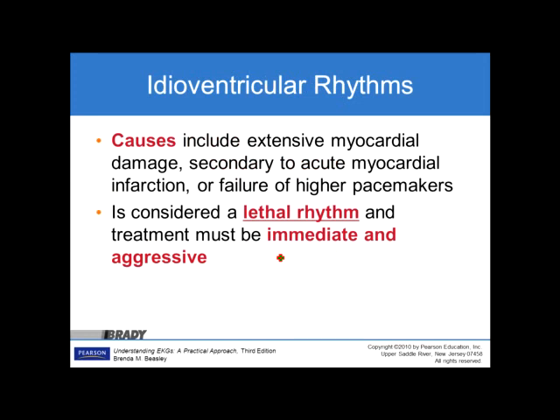Idioventricular rhythm causes include extensive myocardial damage, secondary to acute myocardial infarction, or failure of higher pacemakers. It is considered a lethal rhythm, and treatment must be immediate and aggressive. You need to jump on this. You probably have very, very poor perfusion with an idioventricular rhythm.